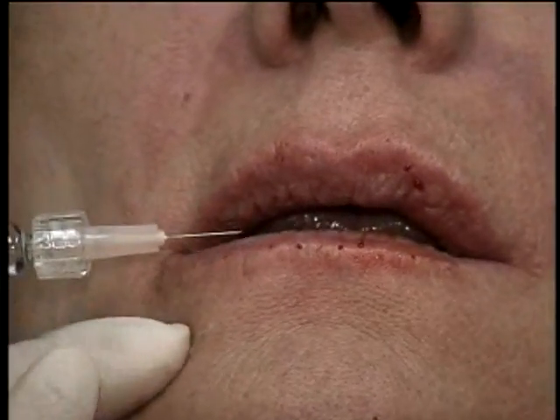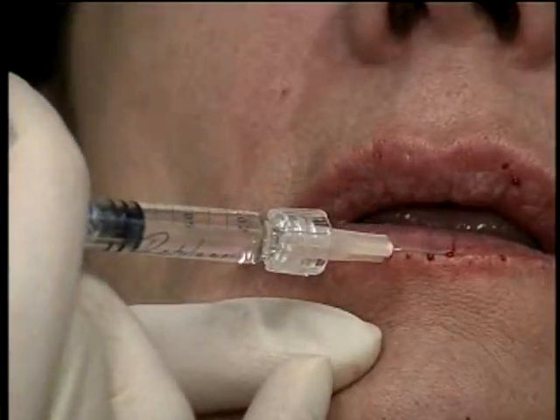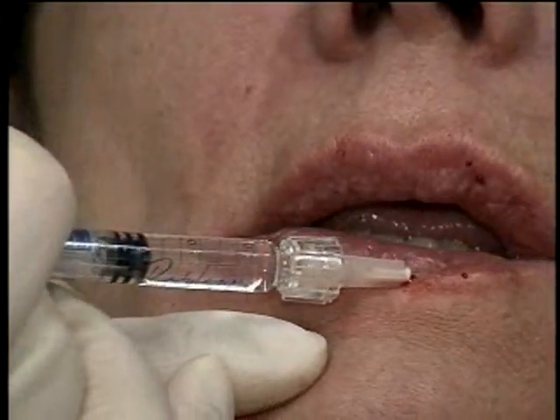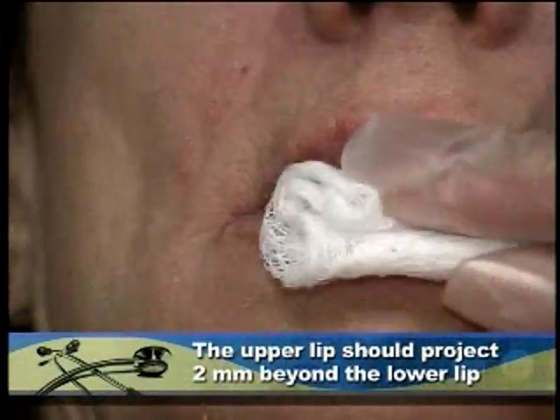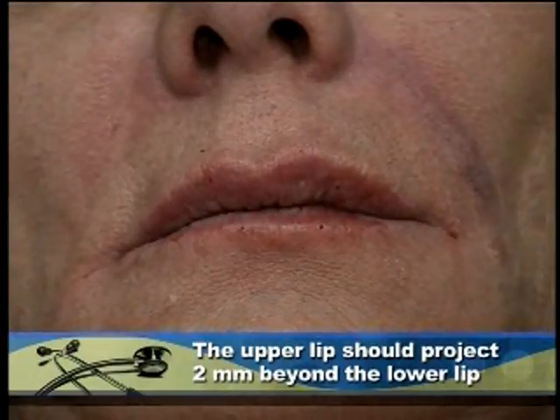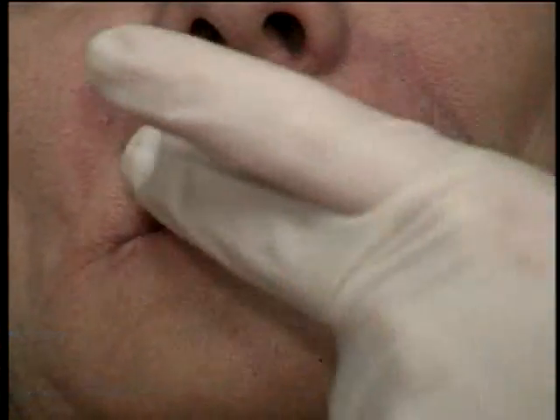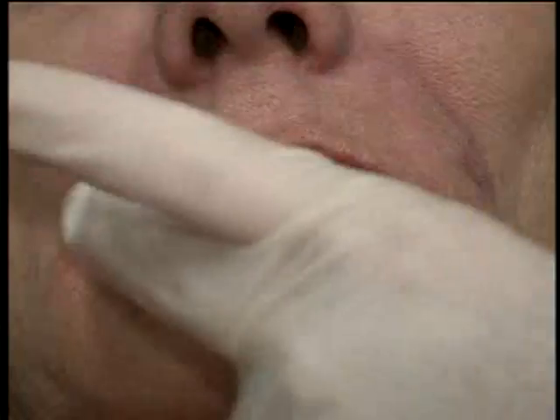Now you can also put a little bit into the lip body itself if you want to make the lip roll out a little bit and a little more red show. Ideally you want the lower lip to be a little fuller. You want your upper lip to project 2 millimeters beyond your lower lip. I palpate the lip to make sure I didn't miss any areas, to make sure she's even and symmetric.